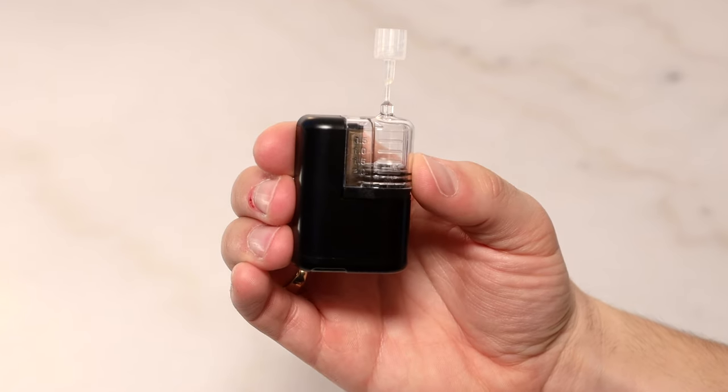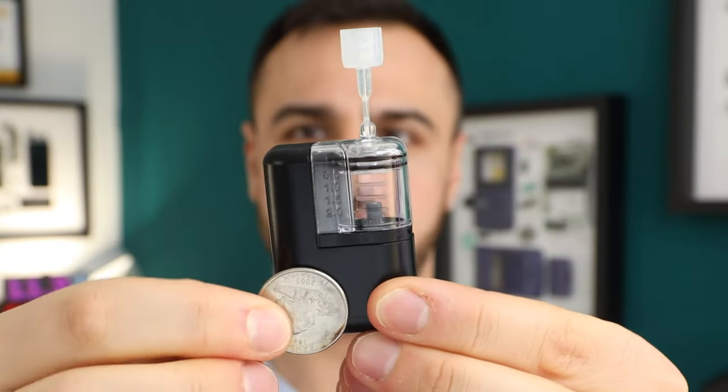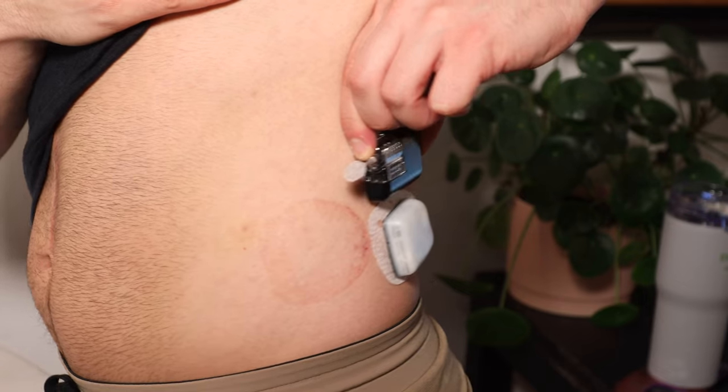I have got my hands on a demo unit of Tandem's Mobi Insulin Pump. I'm so excited to tell you all about it and show you a first look hands-on with this device.